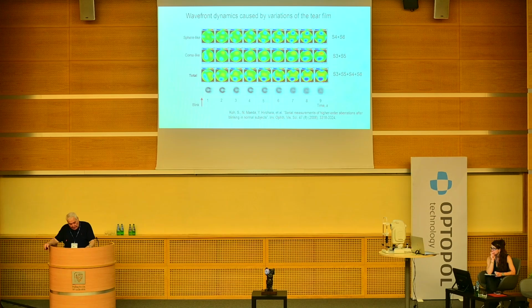So spherical influences the focus as well as coma. And you see that in some moments, for example, at 4, you see the Landolt's sharper than later. So the conclusion: the information is available in the refraction map. So let us look at that.